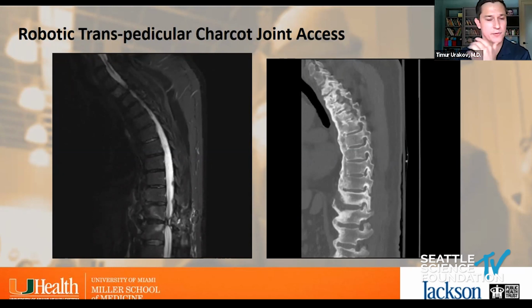So, different ways of treating it, right? There's no right or wrong. Many would do it differently. But here, we like to reinforce the anterior column or allow at least the possibility of fusing. You can do transpedicular decompression, drill out the pedicle, remove a little bit of the rib, get in there and do all that work, which is, of course, always time, blood loss, and considering different comorbidities of the patients that will all accumulate and has to be reflected in the preoperative planning.